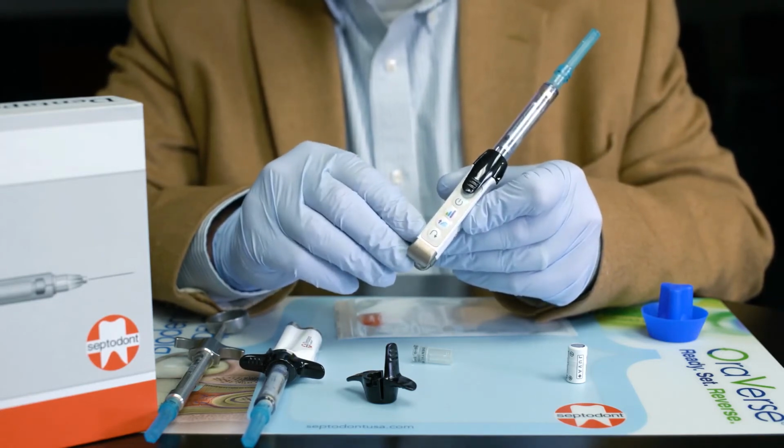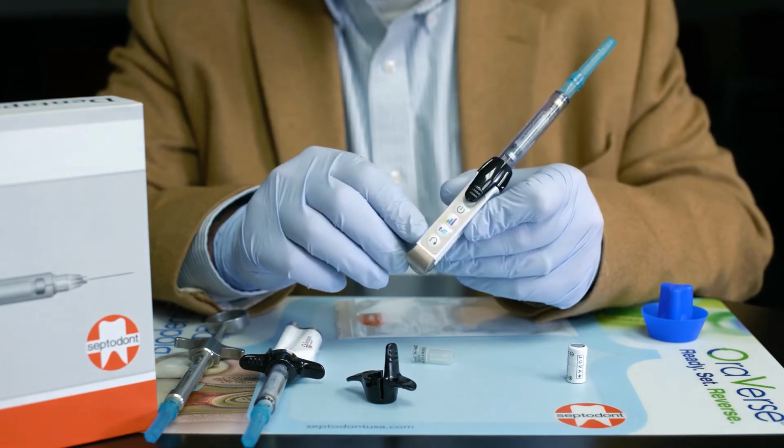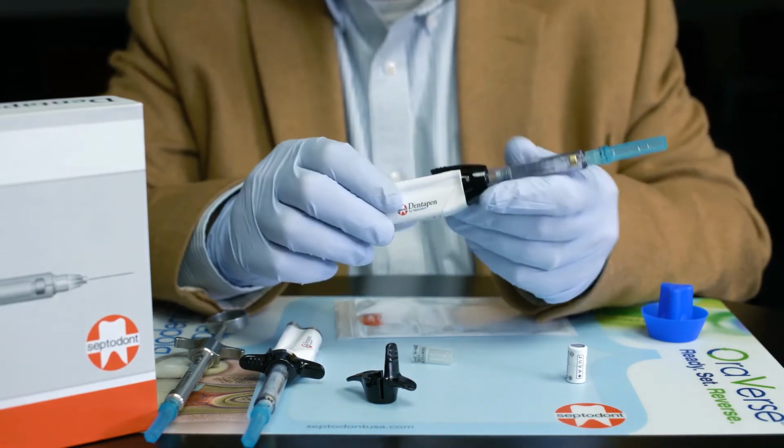The next button is the retract button. When the cartridge is empty, you hit that button and it will retract and allow you to put a new cartridge in.